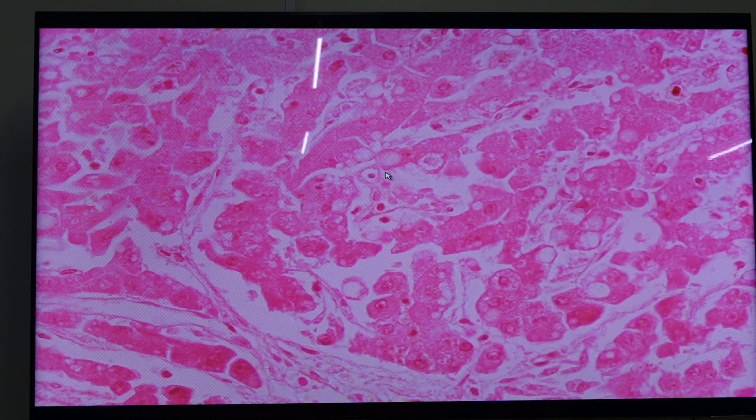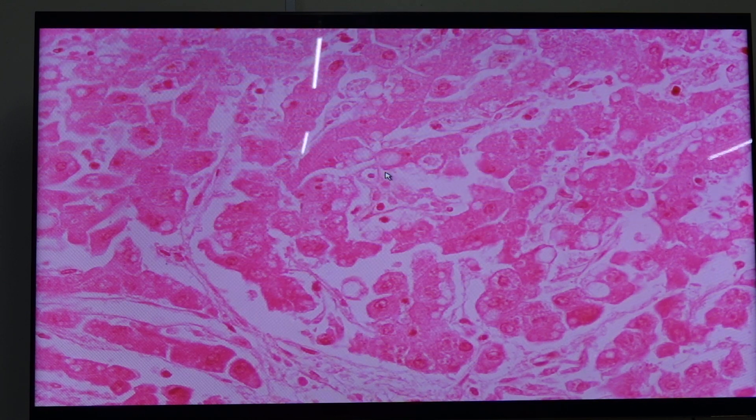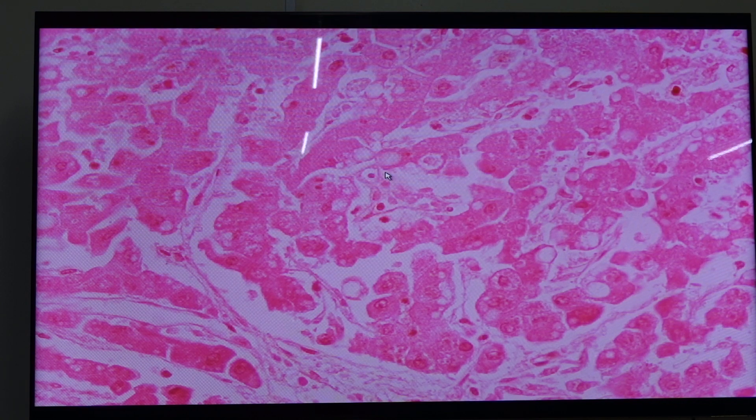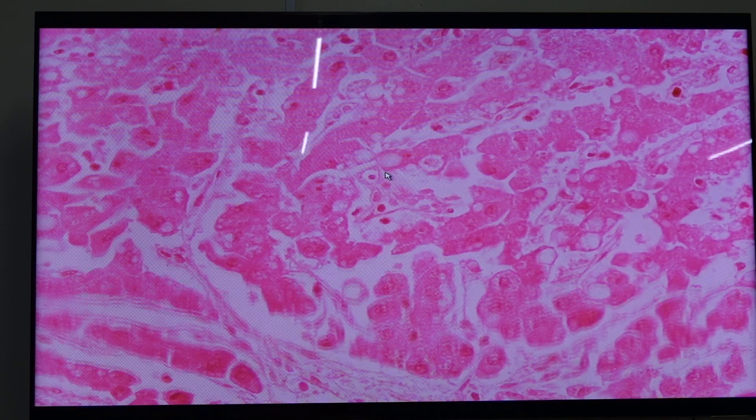So this is submassive hepatic necrosis found with acute liver failure.